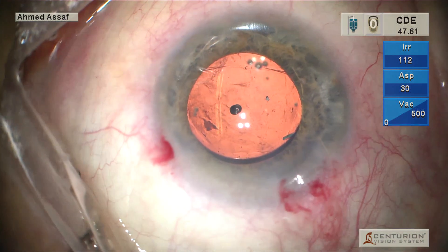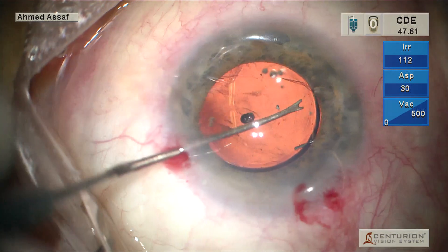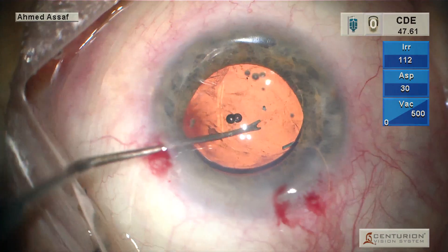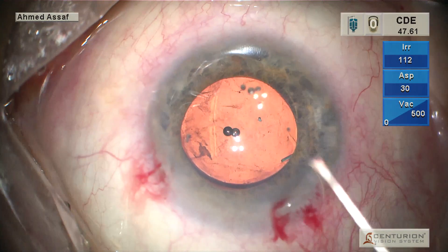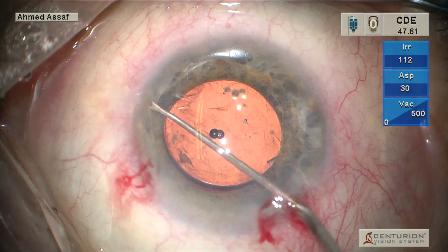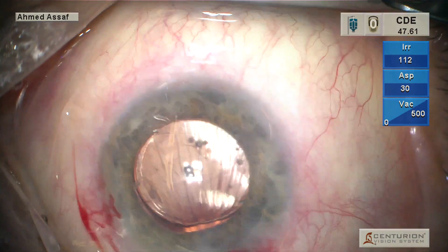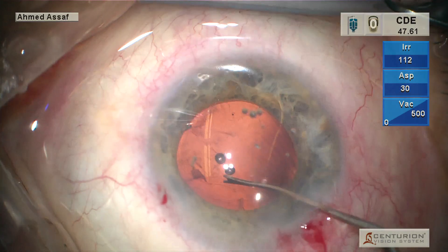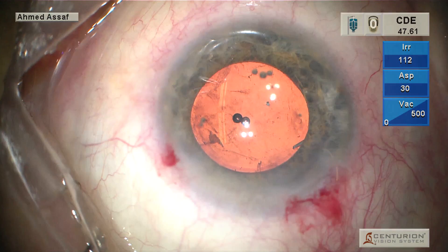This further enhances the stability of the lens for cases of compromised lens capsule stability or compromised zonule. As you can see now, the rhexis has turned to be elliptical in shape, and we have a pretty stable lens, thanks to the optic capture while implanting the lens into the sulcus.